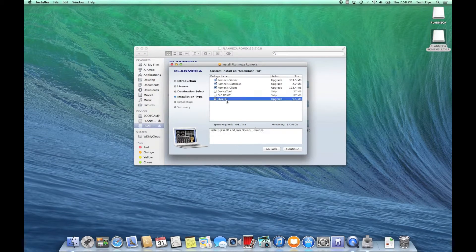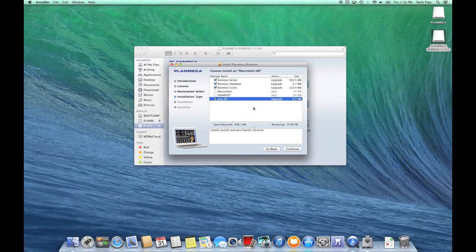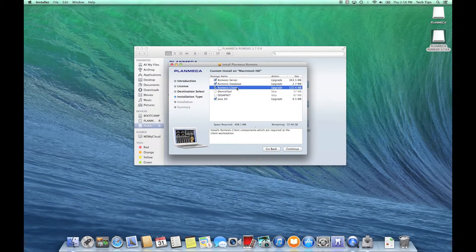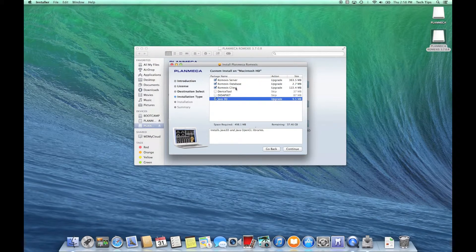Right under that we have Java 3D. This installs the Java 3D and Java OpenGL libraries — in other words, the necessary Java components we need when we actually open a 3D image. Since we have the Romexis client on the server, we might as well leave this checked so that if we do open the client on the server for testing, we have the ability to open a 3D image.